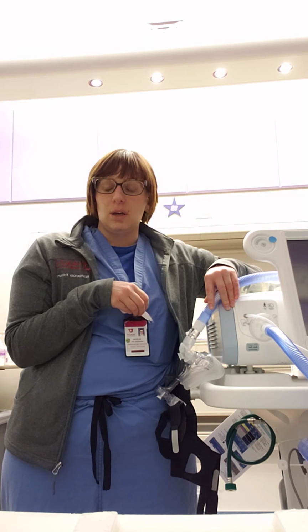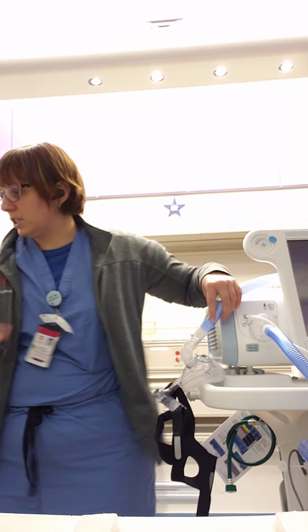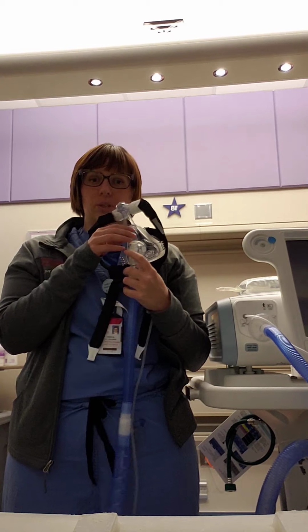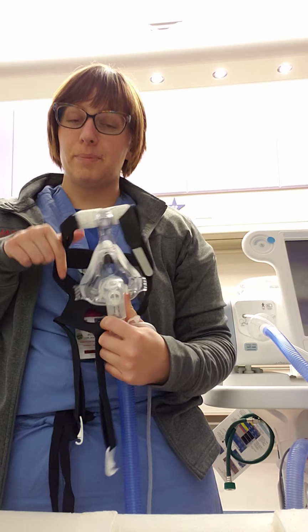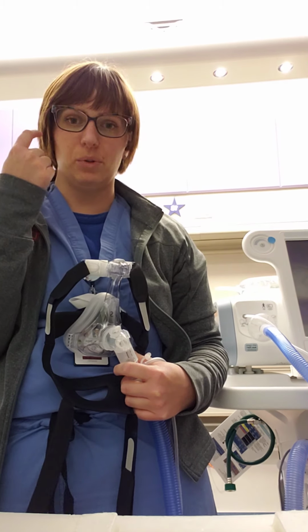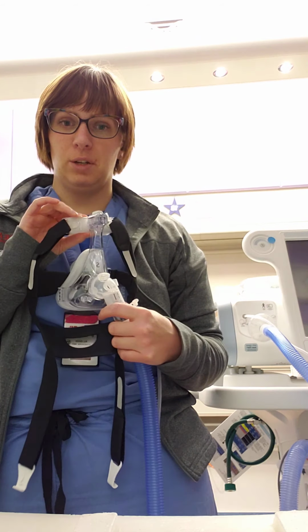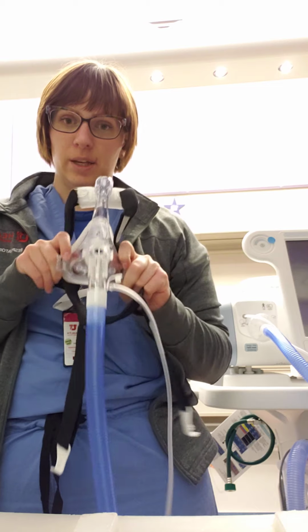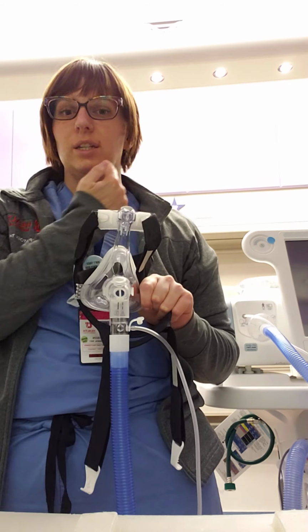Most patients in respiratory distress, you'll use a full face mask, which is like the one we have attached here, which covers the nose and the mouth. But there are other types of masks involved, and we can get into that later, such as over the nose, in the nose, or over the entire face. If a patient is in respiratory distress, use either a full face mask, which is like this, that goes over the nose and the mouth, or what's called a total mask, which goes over the entire face.